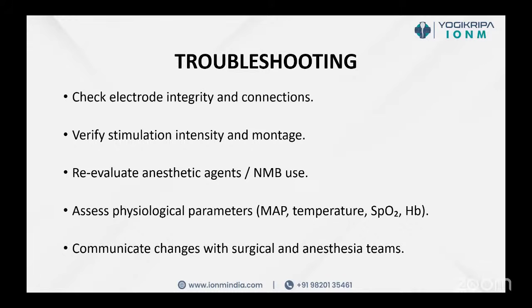Even the physiological parameters, MAP, temperature, SpO2, everything has to be checked and then communicate changes with the surgical and the anesthesia team.